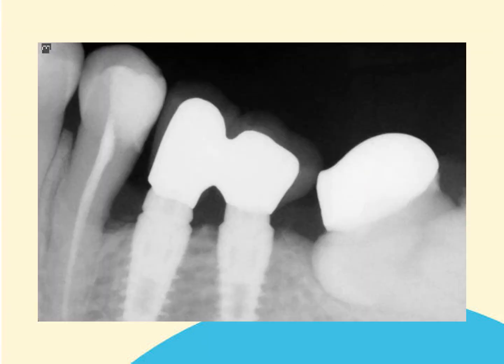This radiograph shows two types of abutment interface. As we've said, the actual sizes and the prosthetics are the same for both. However, we have two varying examples. The implant on the right hand side of your screen has a definite difference in diameter between our abutment and our implant diameter, the abutment being slightly narrower. So this is definitely platform switched, and also this would be a series 2 implant. There is no gap, the abutment fits flush with the implant platform.